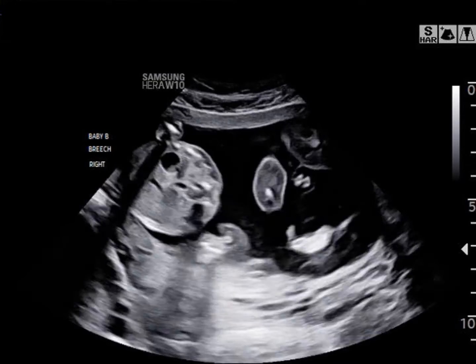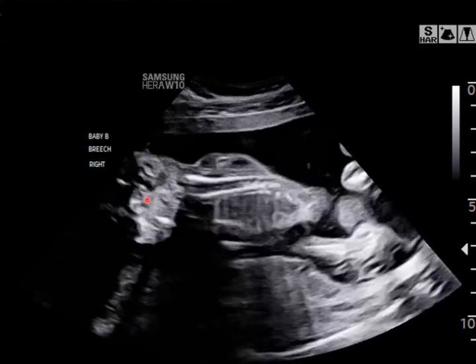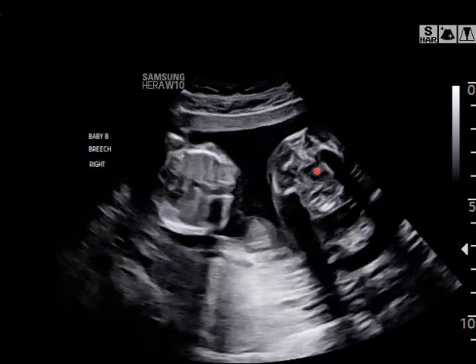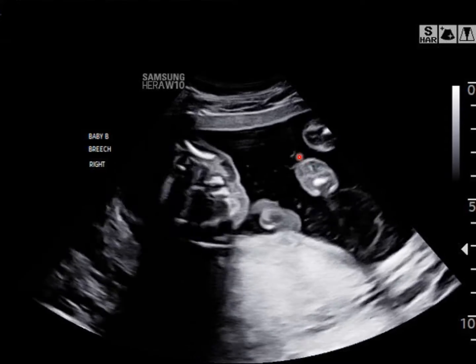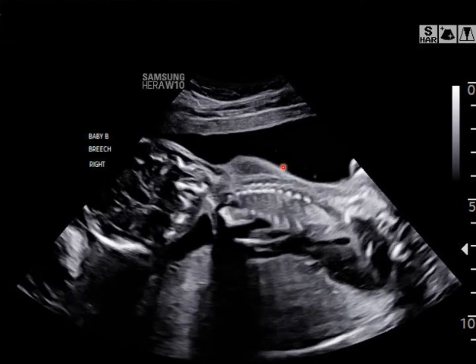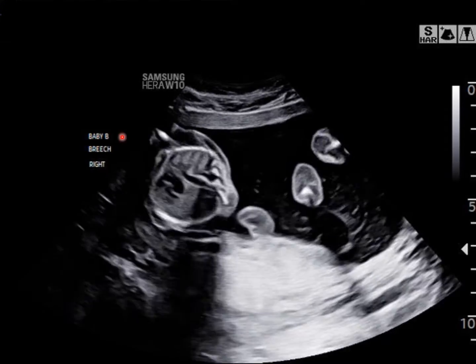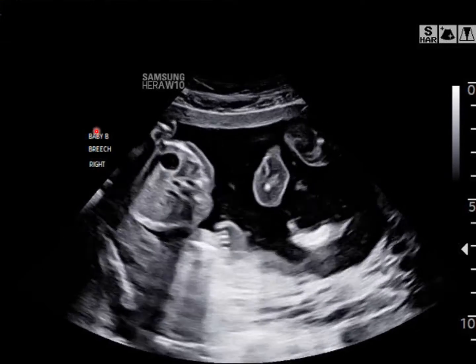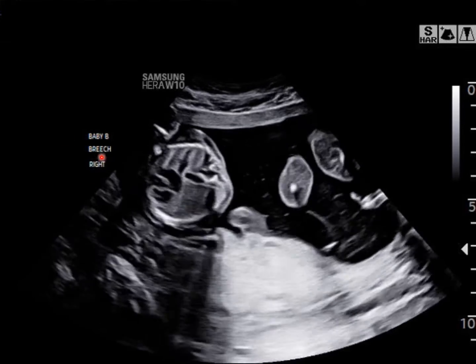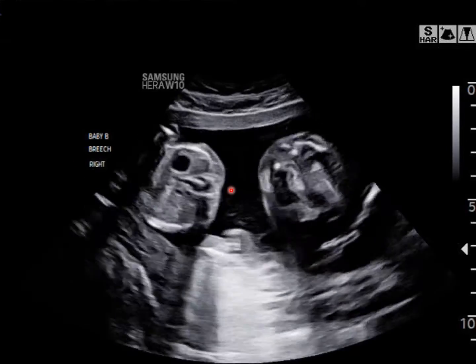A similar method is just to pan all the way out and do a broad overview of both of these fetuses. In this case, I've zoomed out, and I'm making sure that I'm clearly seeing both of these twins, and then I will turn sagittal on the twin that I want to focus on, in this case twin B, and this fetus is in a breech right position.